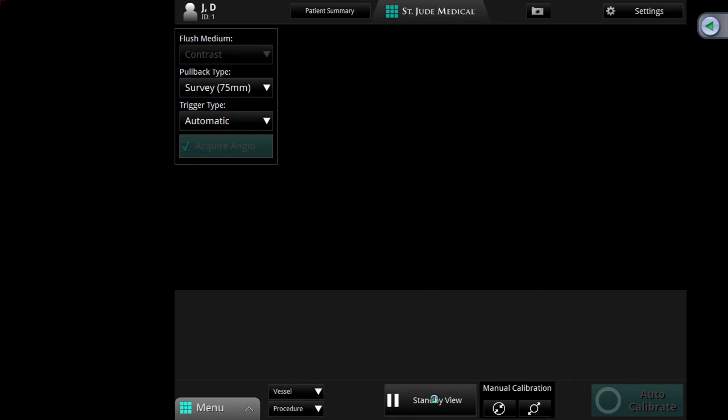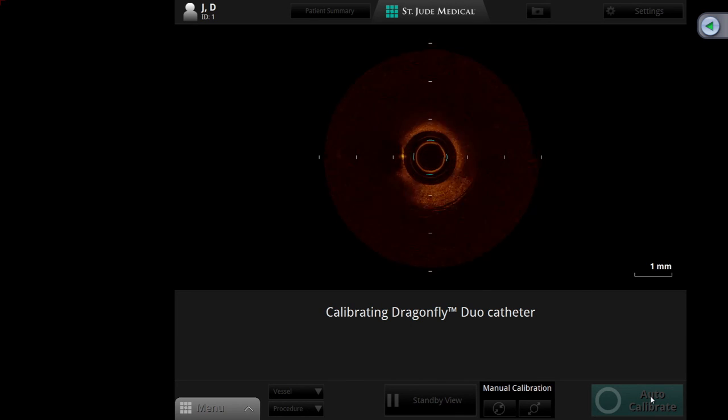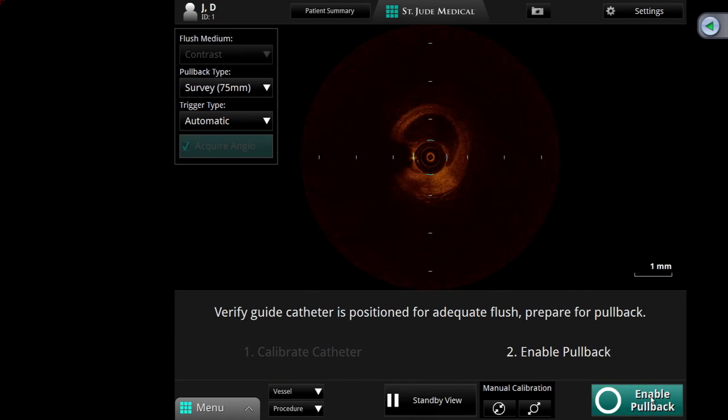Okay, so we are ready for the OCT. Good clearance. There's no dye? Good, right? Closer.